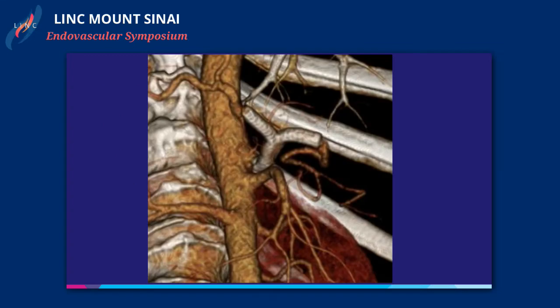On kissing 8mm balloon? Yeah, just flared it proximally. But they were in that celiac. Yeah. The only thing you flared is the aorta. Yeah. No, I didn't try to go up to a 16 in the celiac. We just tried to touch the proximal aspect to flare into the aorta, so if you had to recanalize, you could, and try to make sure you had a good double D seal right there.